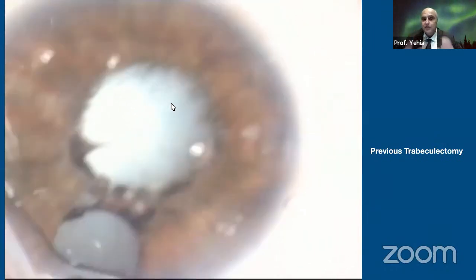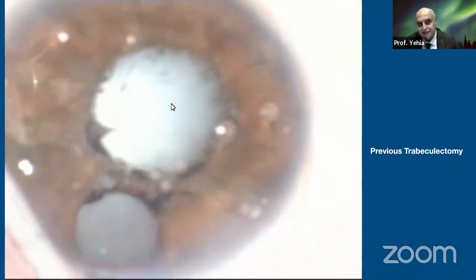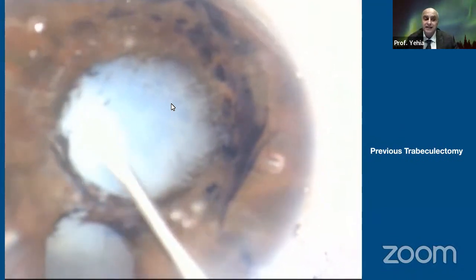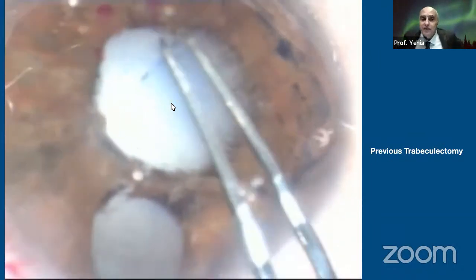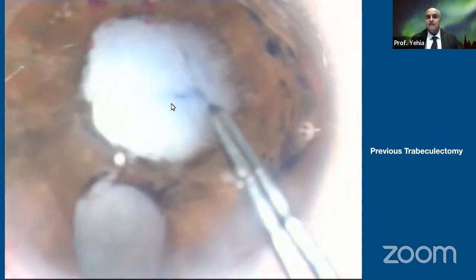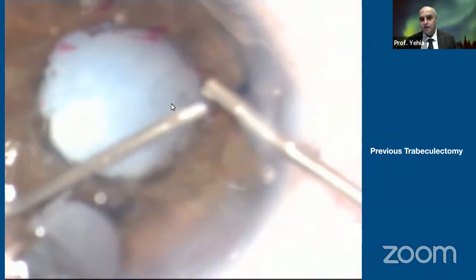You see what the problem is: a shallow anterior chamber. Your main challenge is the capsulorhexis. It is intumescent. There is synechia all over, so you have to get rid of the synechia at the beginning because it will be more difficult after doing the capsulorhexis. One of the nice things to use is the bent cystotome, just to engage the iris and dissect the synechia all over.